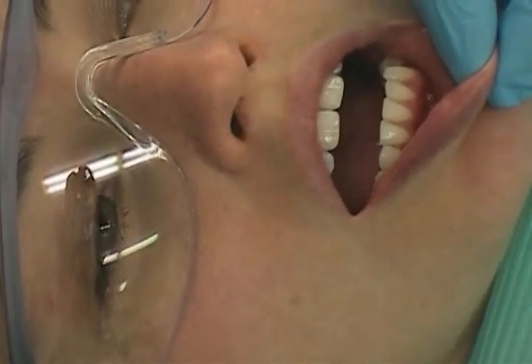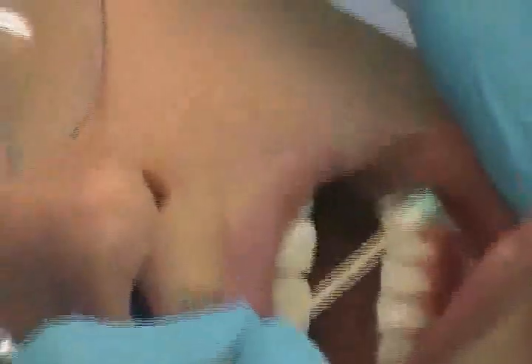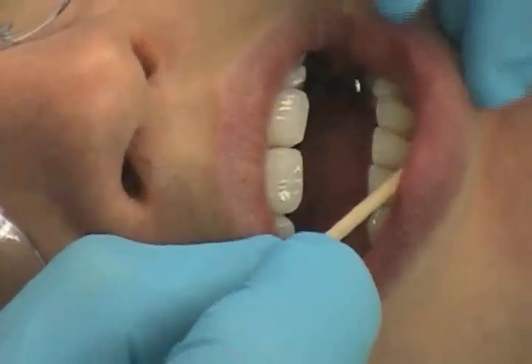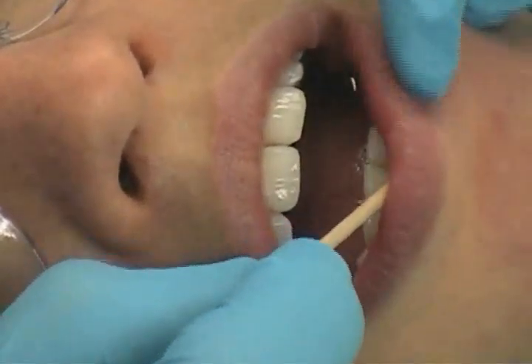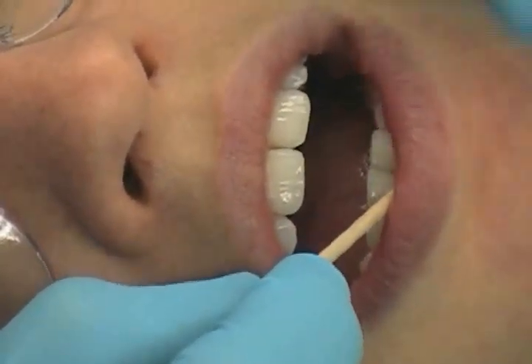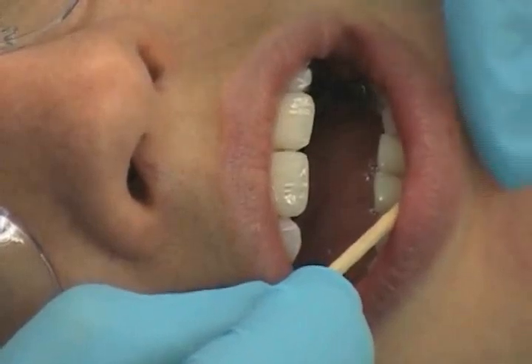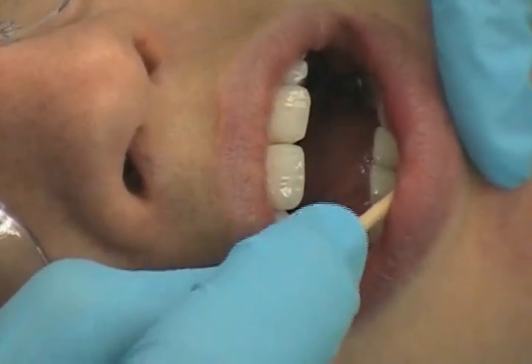For the mandibular, it's only the soft tissue in the area of the tooth. For the needle gauge and length, we're going to use a 25 or 27 short needle.